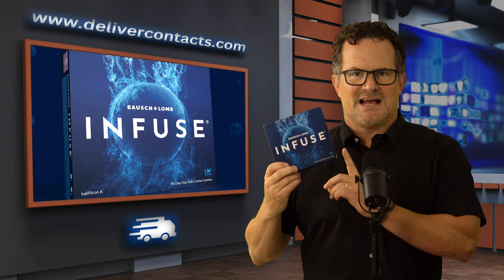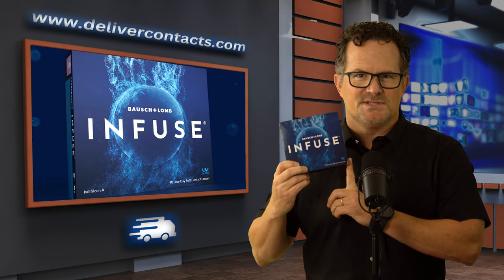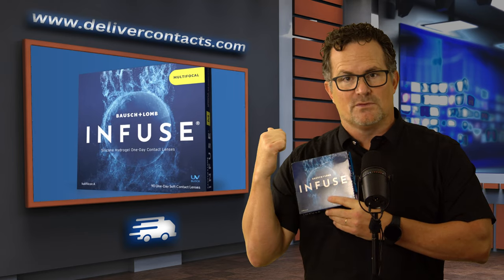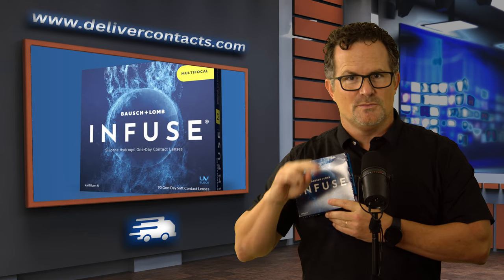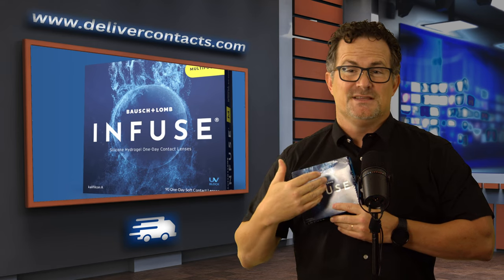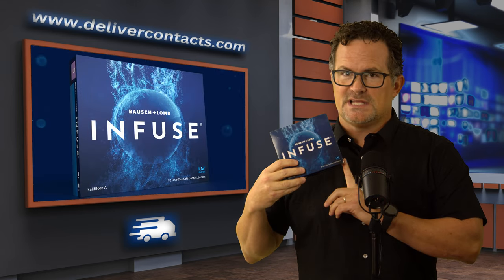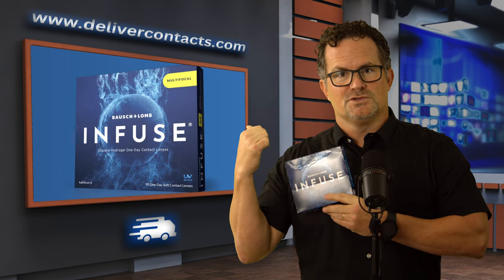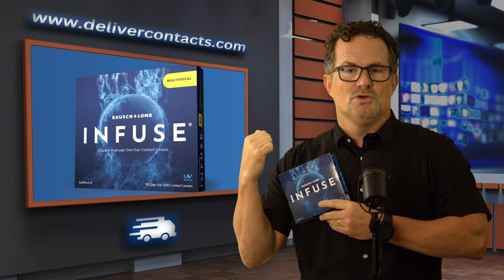In that family there are two types of contact lens. There's the Infuse, which comes in a 90-pack, and then there is an Infuse Multifocal, which also comes in a 90-pack. This is a brand new family — the Infuse came out in 2020, and the Infuse Multifocal just came out in June of 2023.